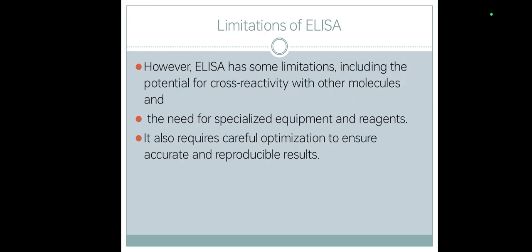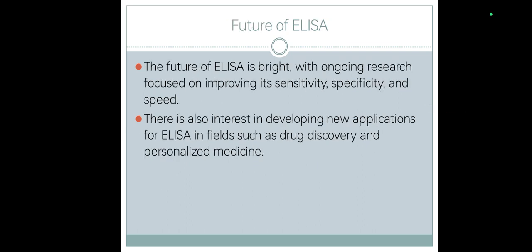As each test has some advantages, it must have some limitations. ELISA also has some limitations. Here we have potential for cross-reactivity with other molecules and the need for specialized equipment and reagents. It needs specialized equipment and reagents. It also requires careful optimization to ensure accurate and reproducible results.